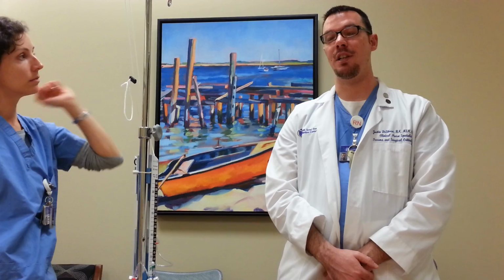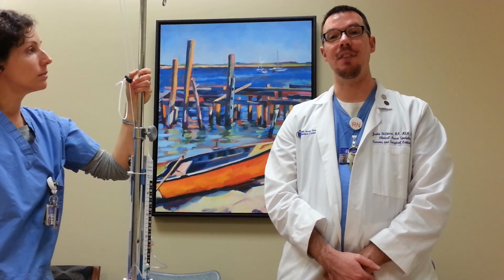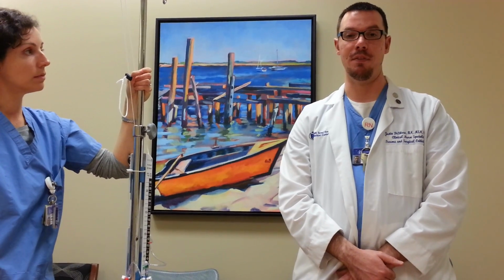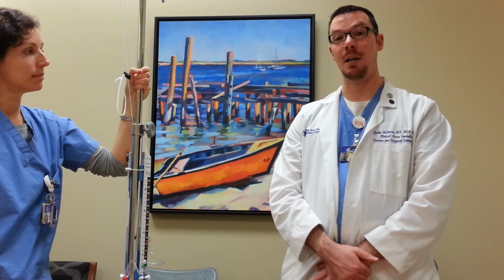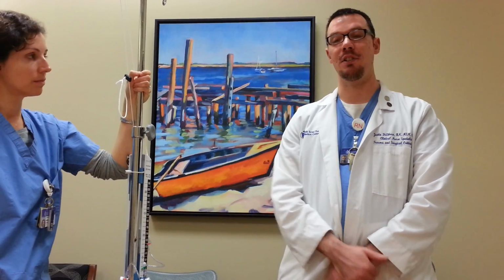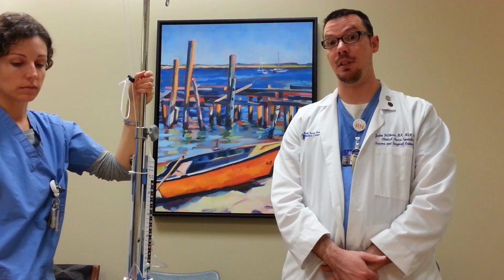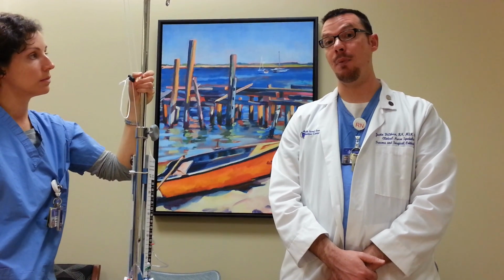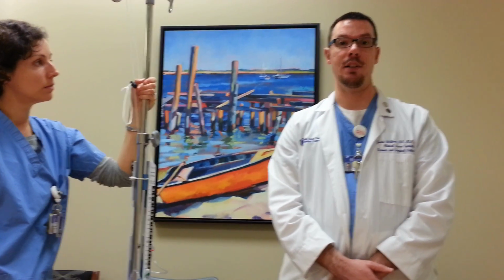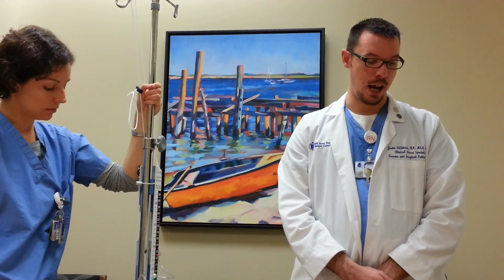In neuroprocedural areas, these patients are particularly high risk because the proceduralist is elevating and lowering the table with little consideration for what's going on with the ventriculostomy. And as a provider managing the ventriculostomy, you can't always anticipate what the proceduralist is going to be doing with the table. So you need to have that very much on your radar in these areas. And we have had situations where patients have had overdrainage in neuroprocedural areas and have suffered harm from that.